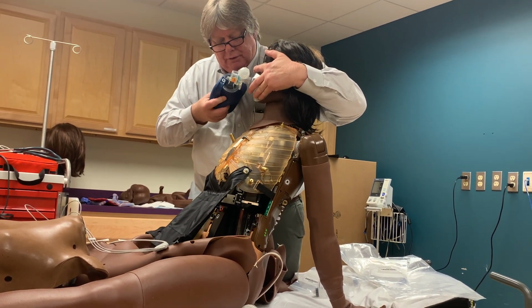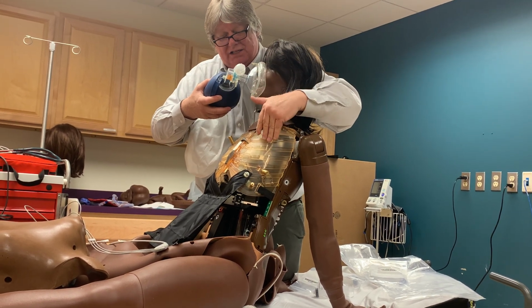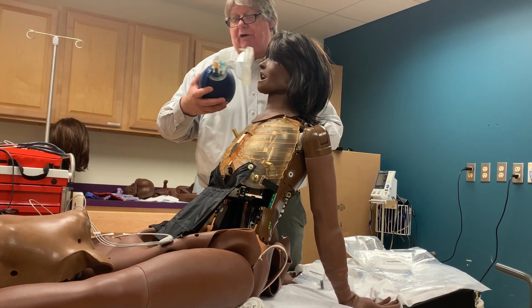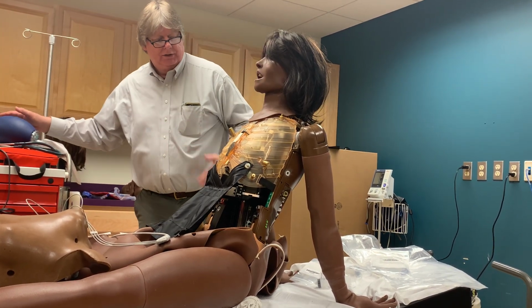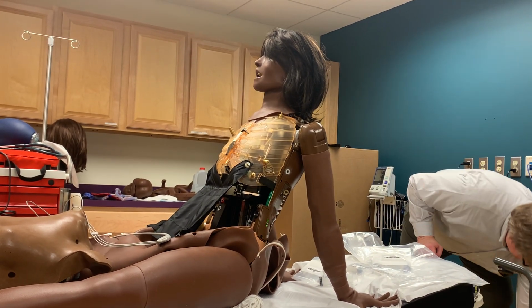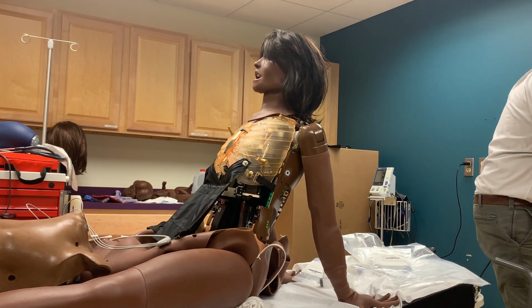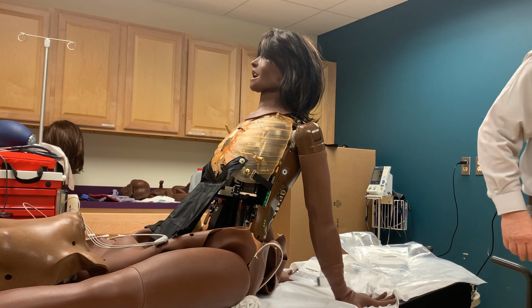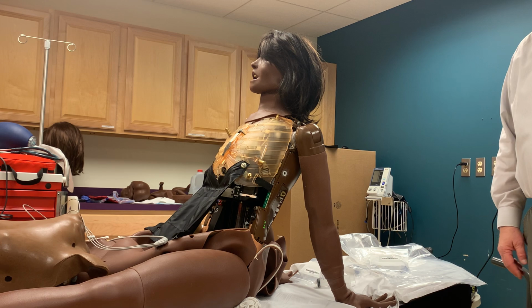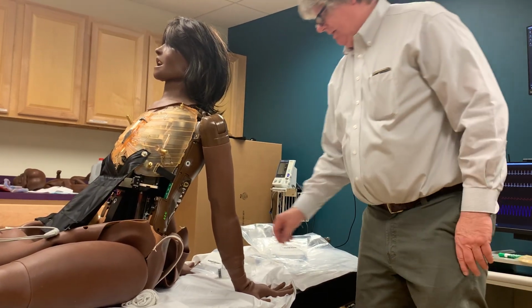So you see how it's all linked together. If the chest is rising, the sound will be generated. I don't need to go into the software and turn it on and off whenever it's going on here. And so now when I release this and let her start breathing again, by clicking off the apnea, she's now going to breathe at a faster rate and a larger volume in here until she blows off that CO2. That's what happens inside her, okay? You get a little bit of idea.